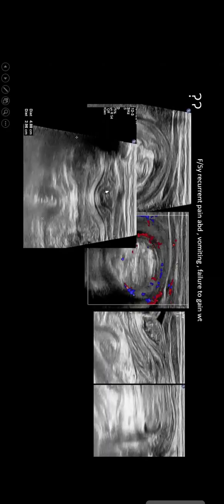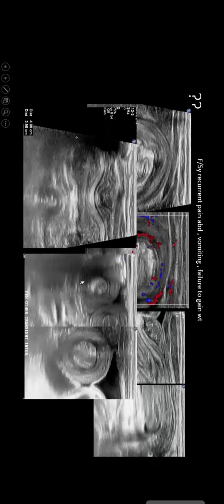So this means the bowel loop is not very much damaged. The child presented with vomiting and some sort of obstruction. The rest of the bowel loops are showing multiple intussusceptions in the same patient; this was the largest intussusception. There were 3 more intussusceptions at various locations, 2 adjacent and 1 another. So these are transient intussusceptions, and this is a well-formed pathologic organic intussusception, in a 5-year-old.